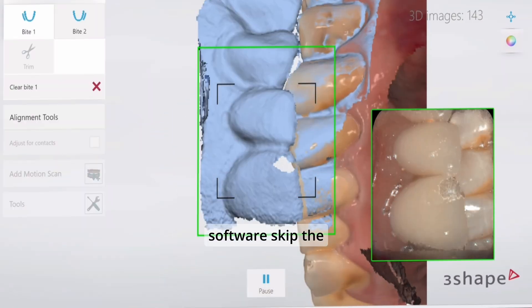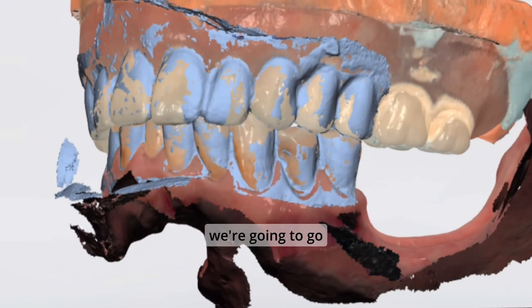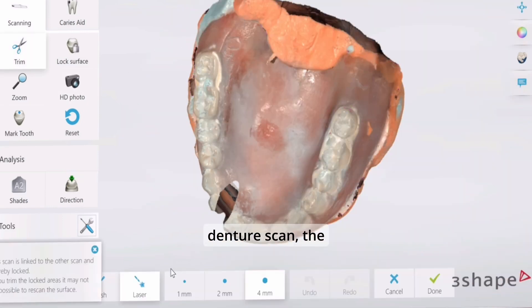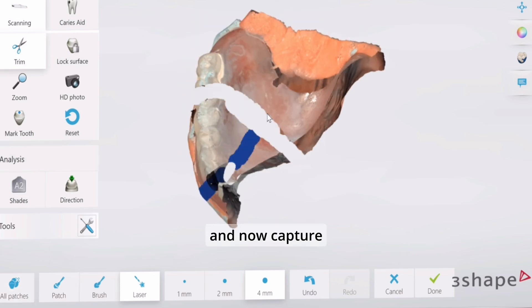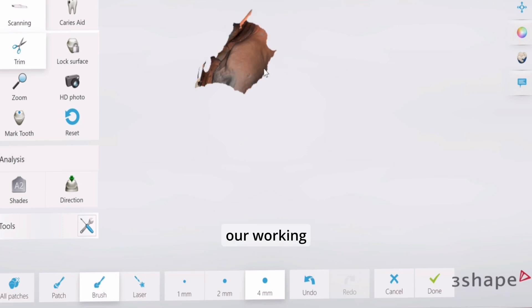In this particular software, we're going to skip the step where it asks us to scan the pre-op, and instead capture the bite using the pre-op denture scan, the mandibular working arch scan, and the bite. Then we're going to go back and capture our intraoral soft tissues on the maxilla as our working arch scan.